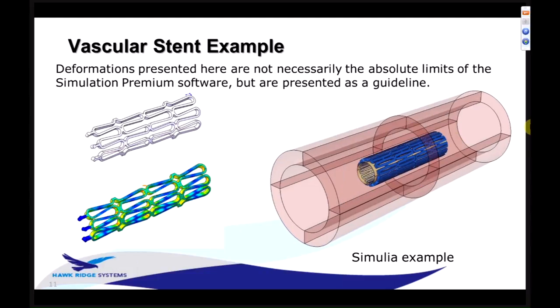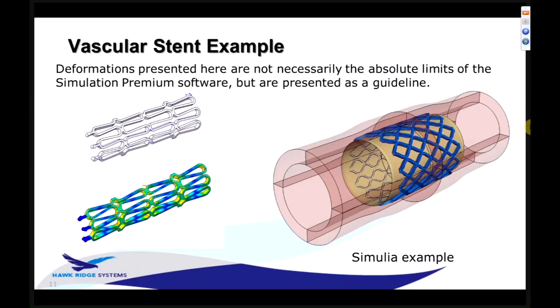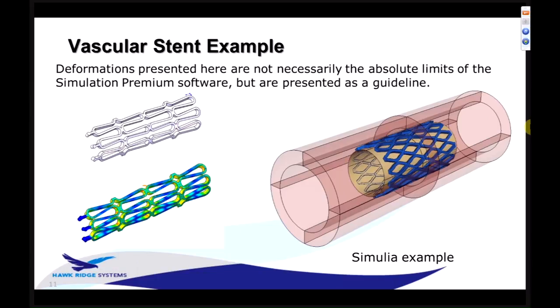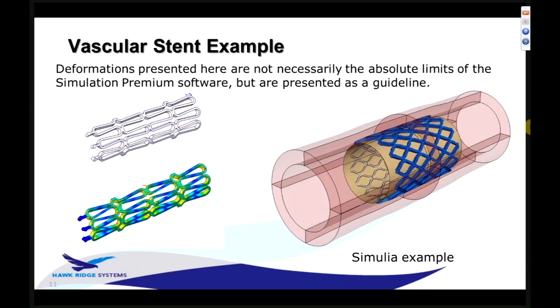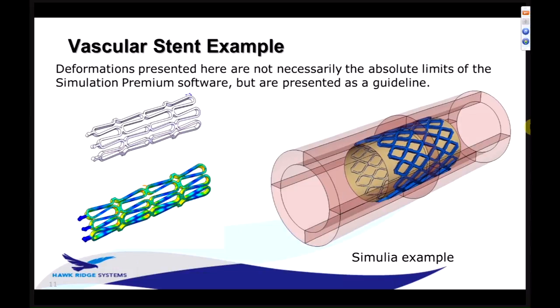They're typically compressed to a very small diameter, put into a syringe or some other injection or delivery mechanism, injected into the patient, at which point they kind of recall their original shape and expand back out to that original shape. And we can approach this in SOLIDWORKS Simulation Premium, but sometimes the degree of deformation and the complexity of the analysis is kind of a step too far.